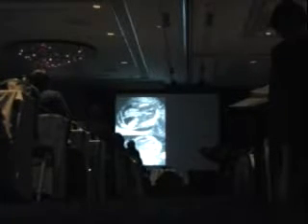Here's an encephalocele that is very large. Here's the transverse and the longitudinal view, showing that this is such a large encephalocele that most of the brain is actually outside rather than inside. You see the choroid plexus, you can see the lateral ventricles, all outside the brain. This has a terrible prognosis. This fetus will probably not survive despite any kind of treatment that might be available.